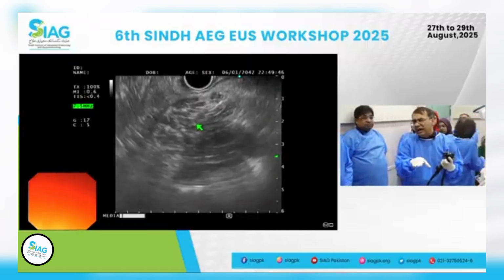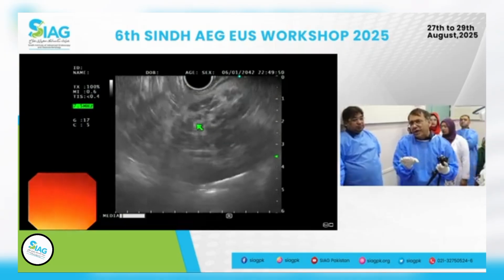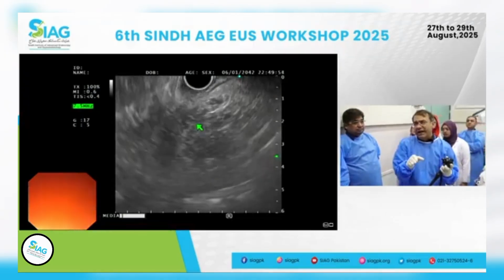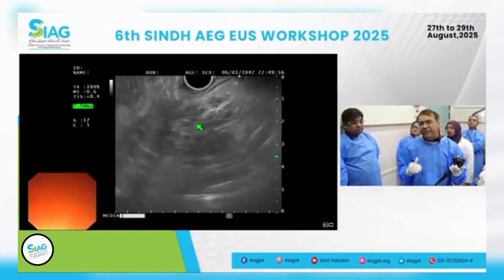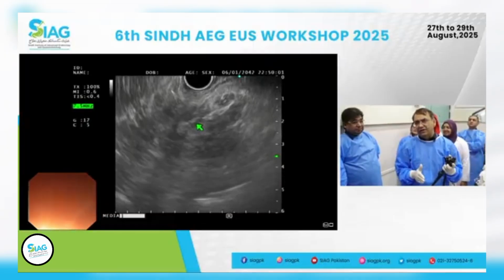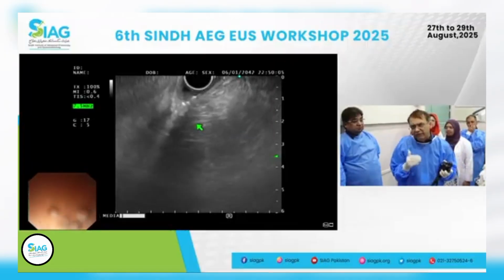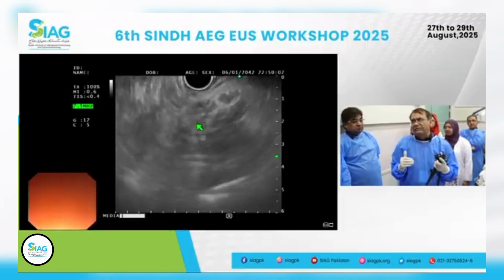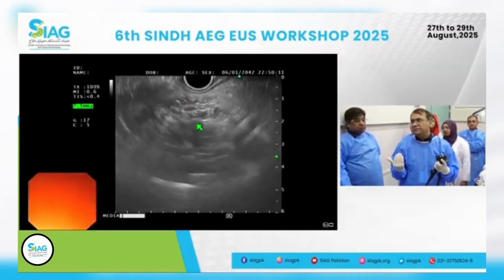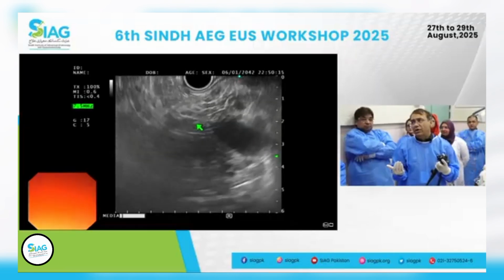As you mentioned earlier, you remember when we started doing EUS in 2012, I thought initially that every patient basically had at least 3-4 criteria of pancreatitis. So I think it's a different pancreas in this part of the world as compared to the Western population. Yeah, when I came back and I started, I thought everybody had pancreatitis. Exactly. So chronic features of at least parenchymal features, but not the ducts.